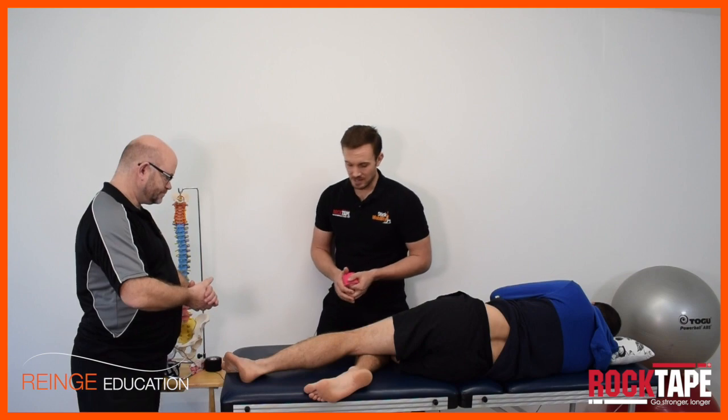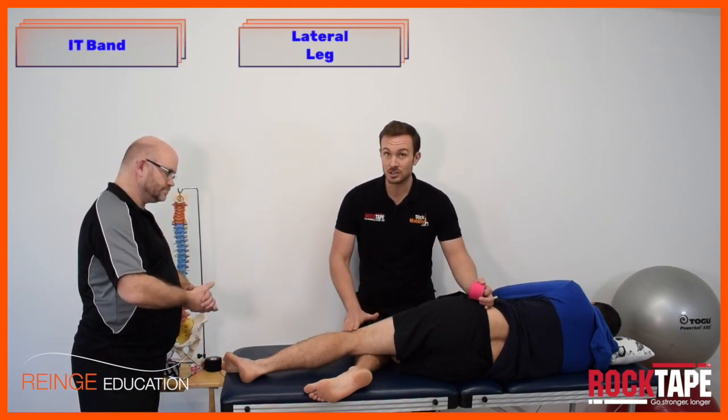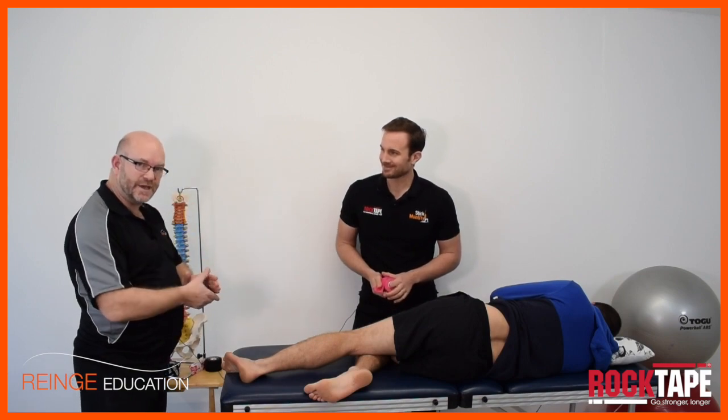This is the taping technique for the ITB, for the lateral leg, and it can be helpful for any pain conditions over the lateral leg as well, including runner's knee and lateral hip pain. Fantastic — a double application.